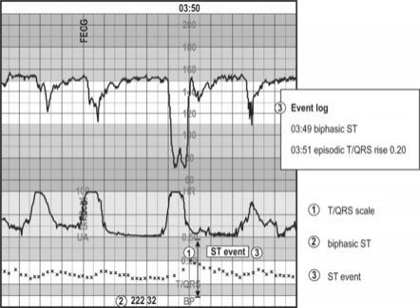For those concerning tracings in the fetal heart rate only group, they use conservative measures and scalp stim to reassure the provider. If the tracing remained non-reassuring, they moved to delivery either by cesarean or operative vaginal delivery. In the pulse ox group, they applied the probe to the fetal cheek. If the oxygen saturation was greater than 30%, they considered that to be reassuring and continued the labor. If saturation was less than 30%, they reverted back to the standard fetal heart rate algorithm.